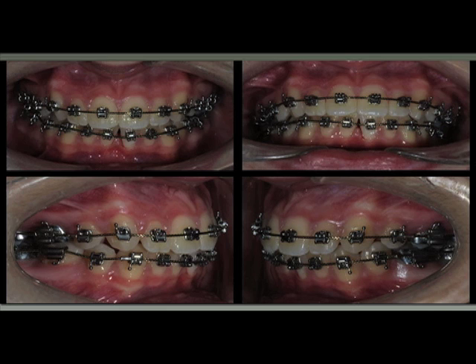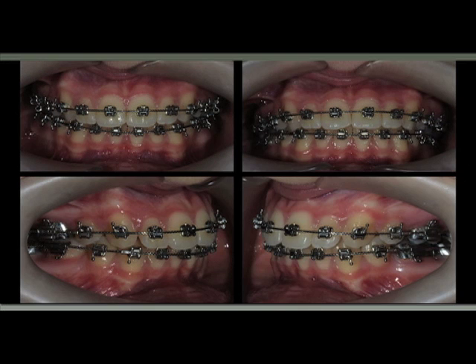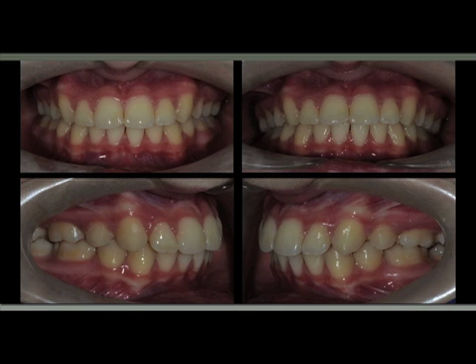As you can see over here, there were some few problems, specifically two, in the area of the lower incisors. There was a black triangle because the lower left central incisor was inclined, that was bracket position, and also the lower first premolar was not seated in. So I moved the incisor to the right position, the bracket, and I moved the lower right premolar down and distal, and I asked the patient to wear a couple of very short vertical triangles in the right and in the left, and you can see how in one visit you go from here to here and the bite settles. So we were able to seat that premolar in and basically to close the black triangle by aligning correctly the lower incisor. And that's the finished case.